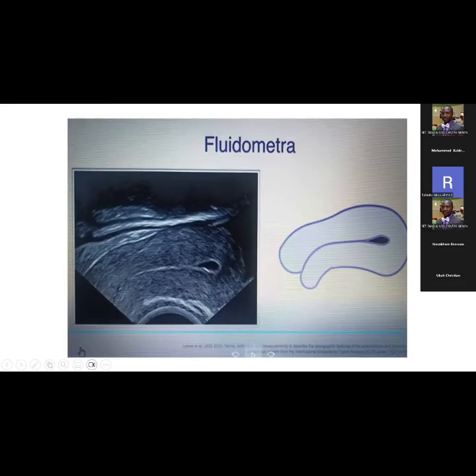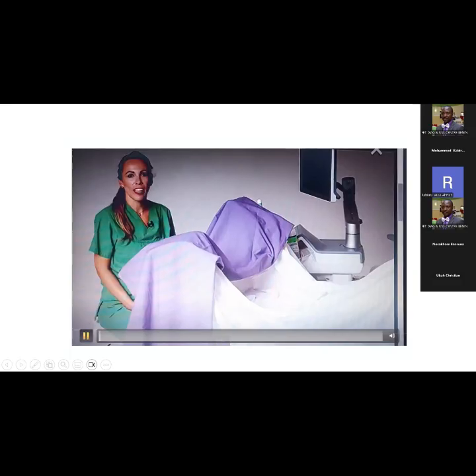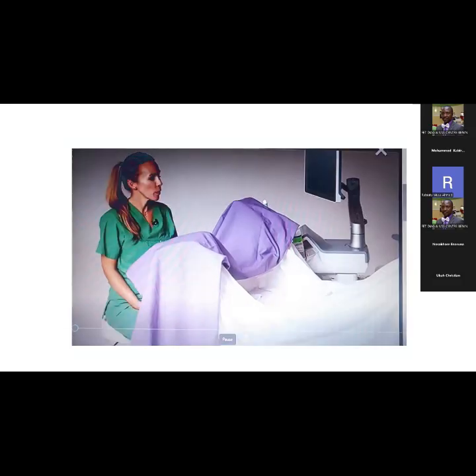So you take the measurement of the endometrium in 2 segments, anterior and posterior, and you add them. That becomes the endometrial thickness, excluding the portion of the fluid. The next couple of slides will just depict videos to put some of these things into practice.